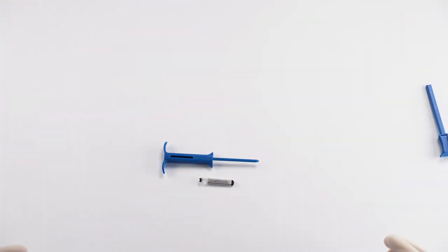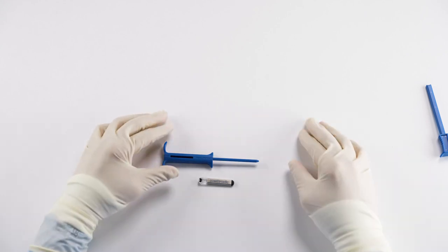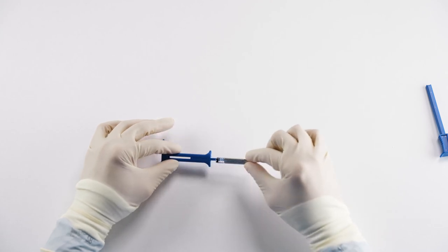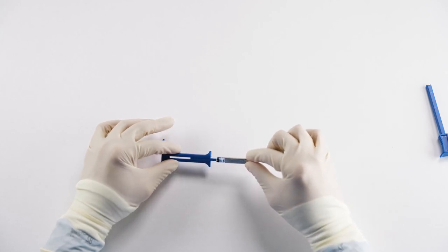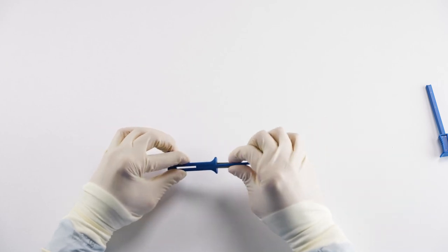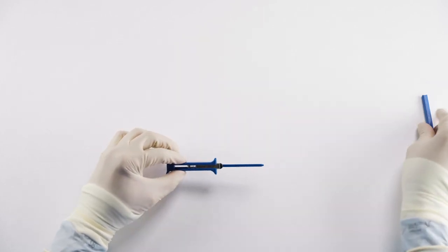If the Medtronic RevealLink device is suboptimally positioned, a reposition may be necessary. To do so, you can use a grasping tool of your choice to gently remove the device from the patient and realign the word 'Medtronic' upright both on the Medtronic RevealLink and on the insertion tool, insert it into the chamber, and push it gently until you hear a click. Now the device can be reinserted.